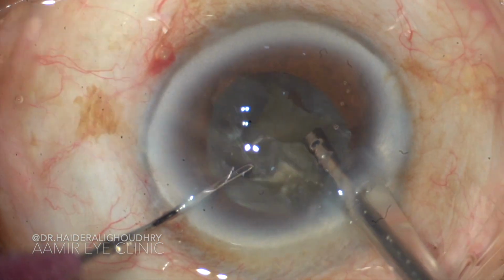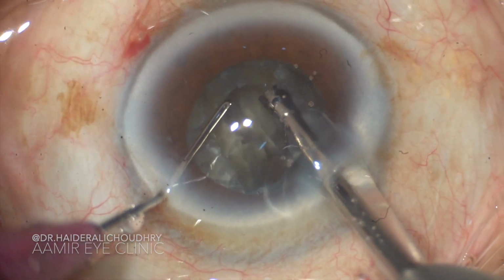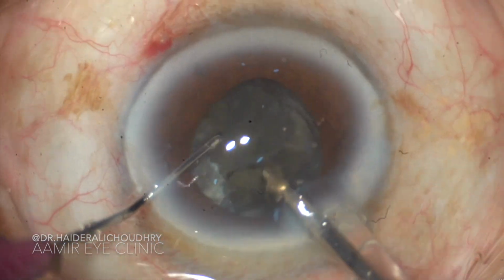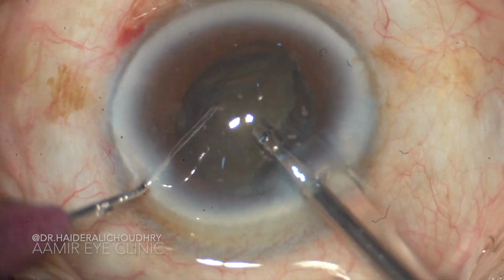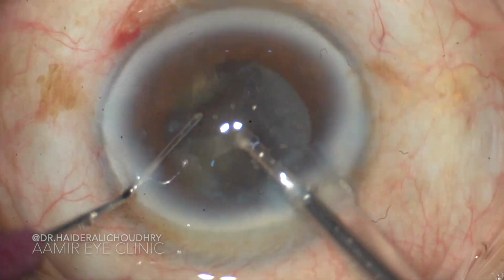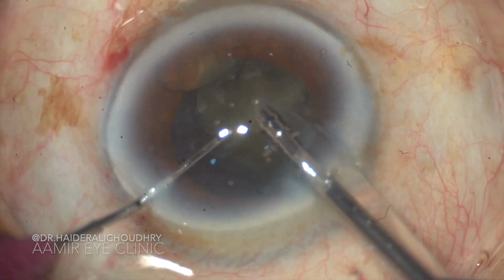The phaco settings being used for this case are a vacuum of 450 mm of mercury and an aspiration flow rate of 45. The phaco power being used for this case is 40%. Now these are the last two fragments.